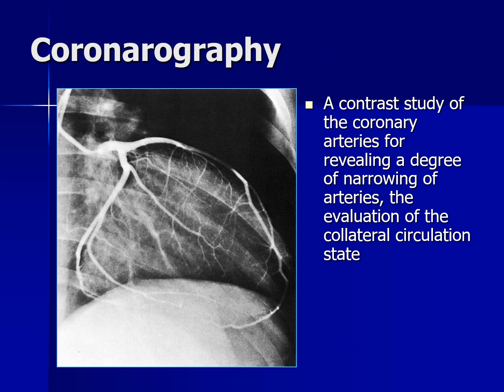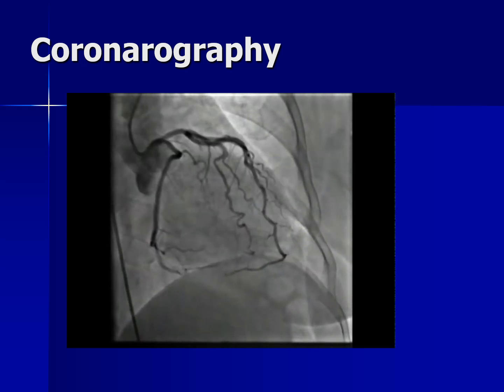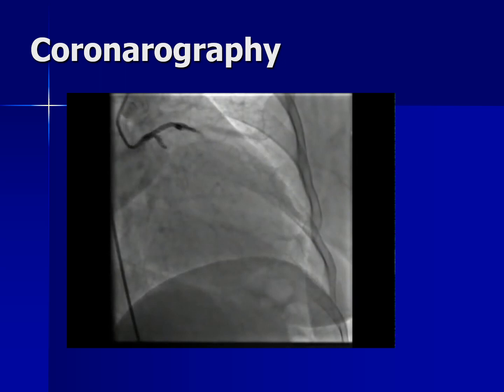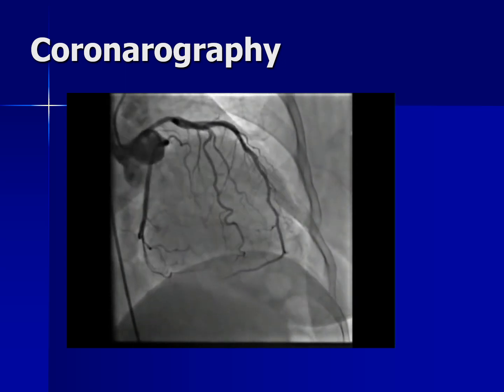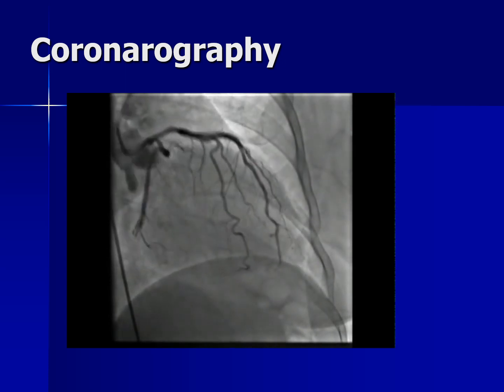What is coronarography? It is a very important method, a contrast study of the coronary arteries for revealing a degree of narrowing of the arteries and evaluating the state of the collateral circulation. Here you can see a video of how coronarography is made. The contrast agent is in the coronary arteries of our patient.